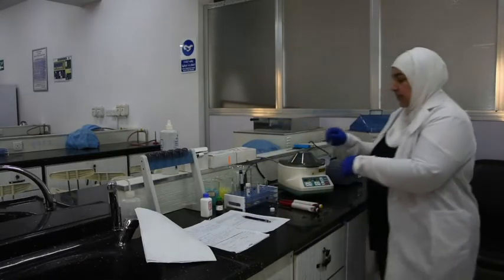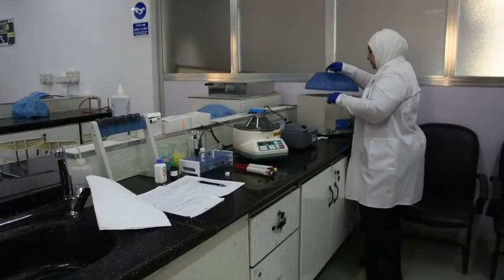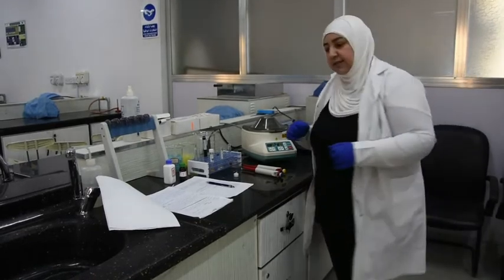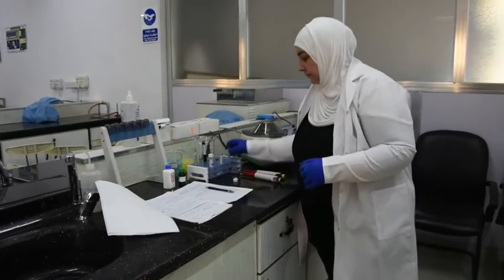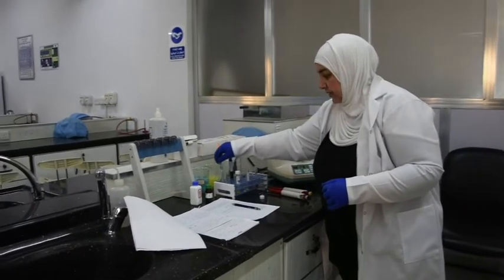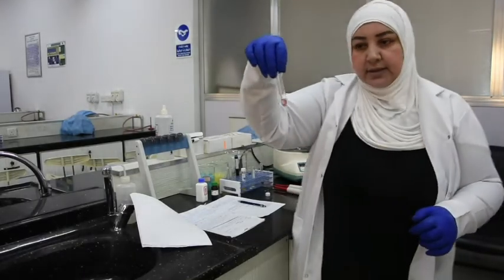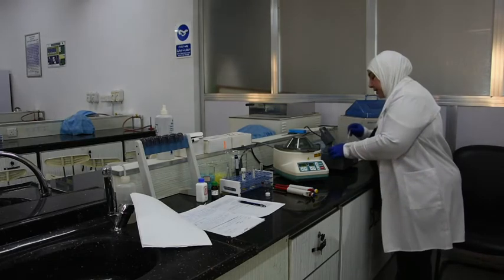Mix, and we need 5 minutes in the water bath. After 5 minutes, we see the change in the color, like this.